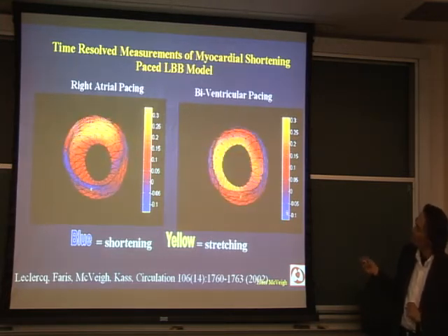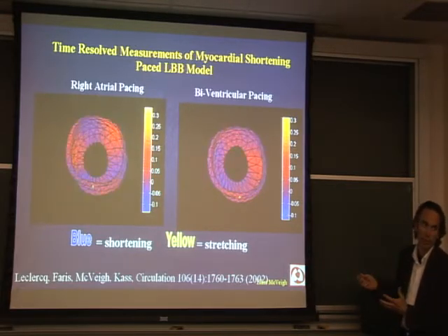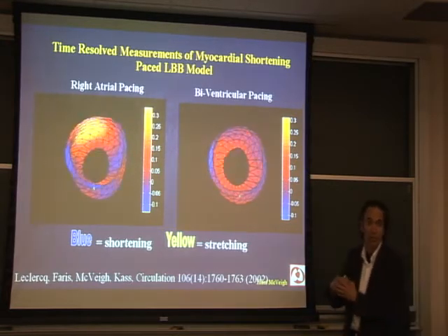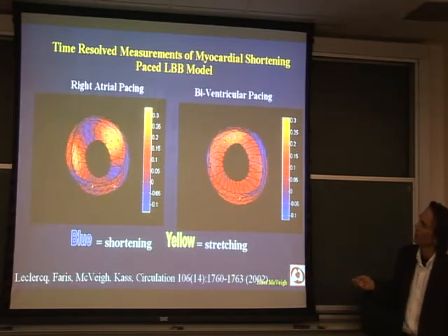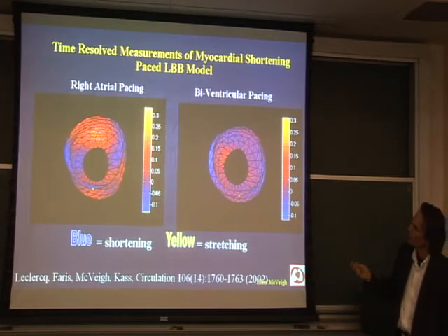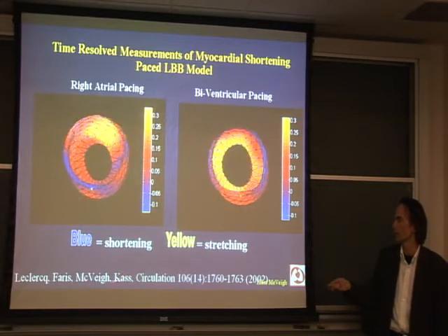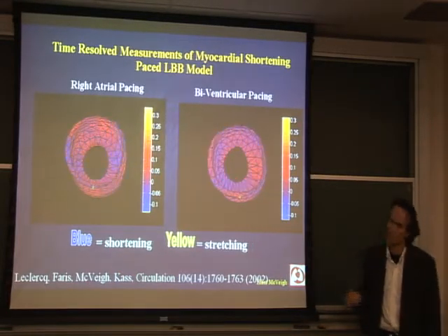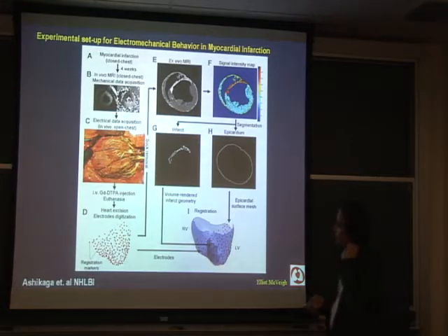And the color code again, remember, is circumferential shortening. This isn't electrical activation. This is actually the mechanics of the heart beginning to shorten. It looks a lot like an electrical map. They're analogous, but the blue means shortening. So we resynchronize the heart there. And a number of papers were published with Dave Taft, myself, and others looking at using this type of MR imaging to evaluate those patients and resynchronization therapy.